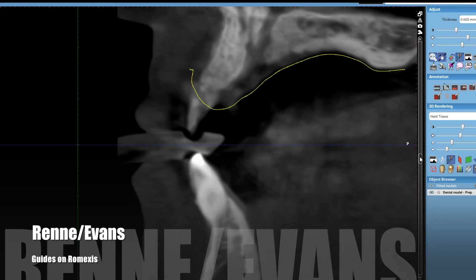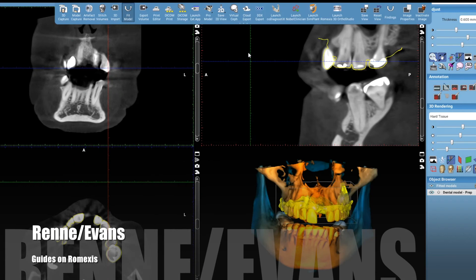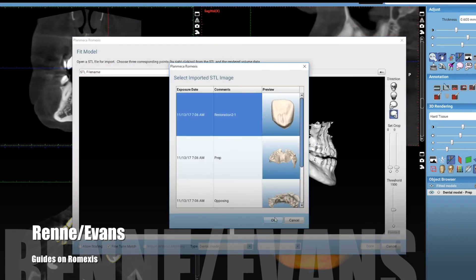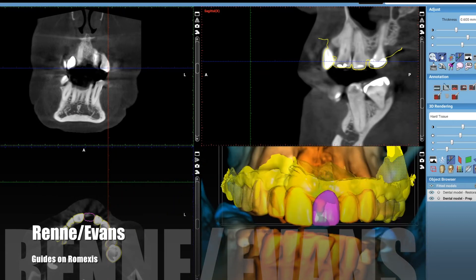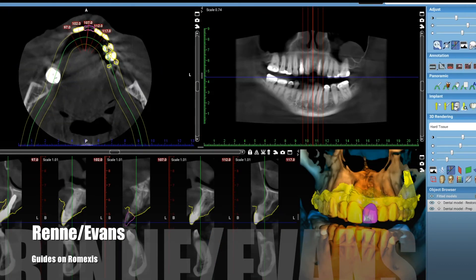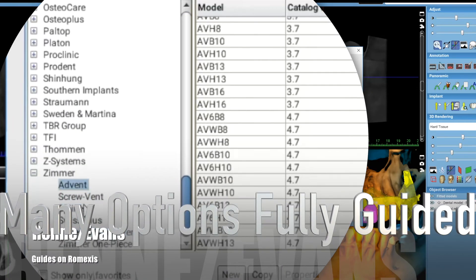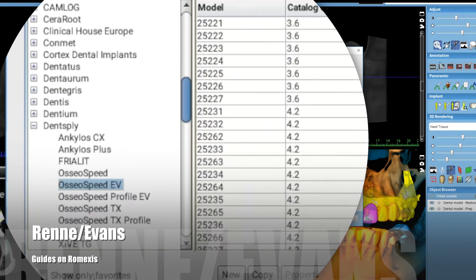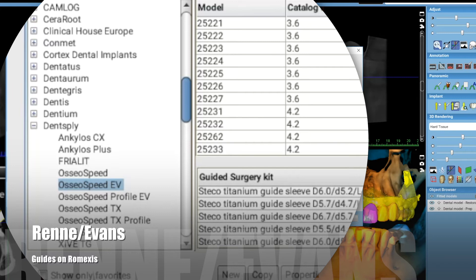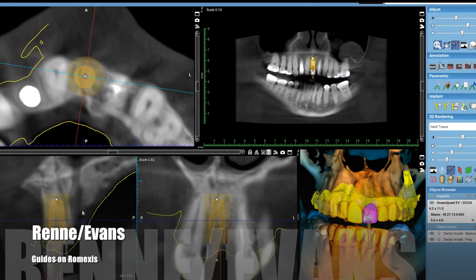Now we're going to bring in that number nine that we designed in PlanCat Easy and it's going to place it right where you designed it. Now we have all the information we need to plan this case from an angulation, location, and depth standpoint. With Romexis you have a huge number of options for fully guided implant cases, especially now with the Stecco sleeve integration. Here I'm going to do a DentsplySirona OsseoSpeed EV 4.2 by 11 and use a Stecco sleeve for the fully guided workflow.